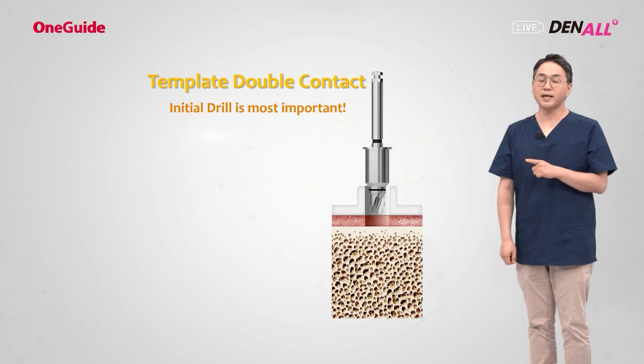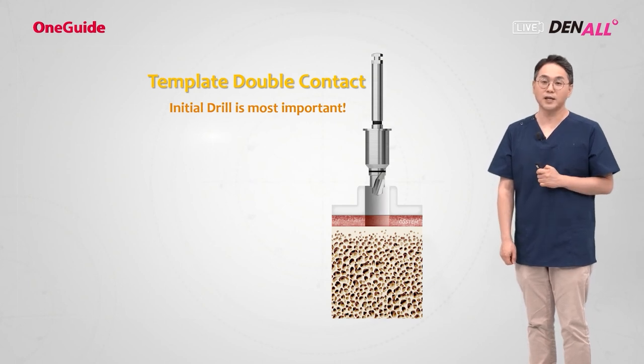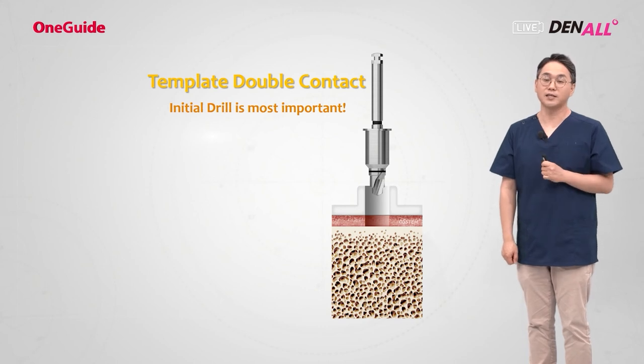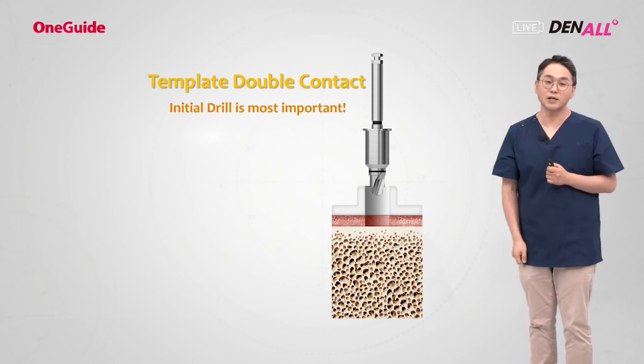But the initial drill does not contact the bone. The contact is only between the guide barrel and the inside of the guide hole. So accurate initial drilling is important.